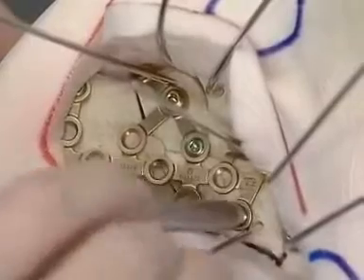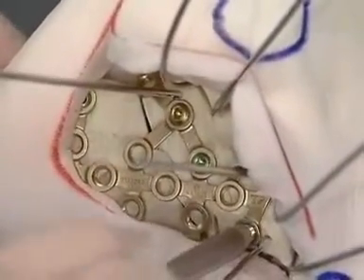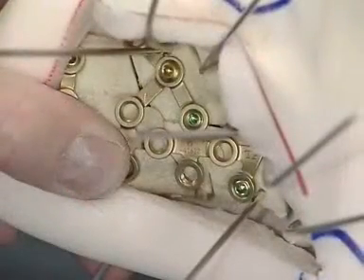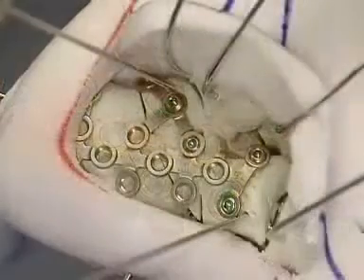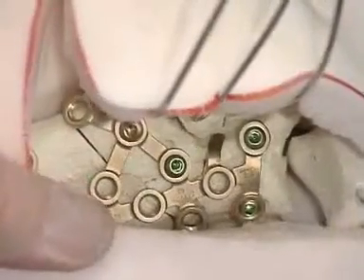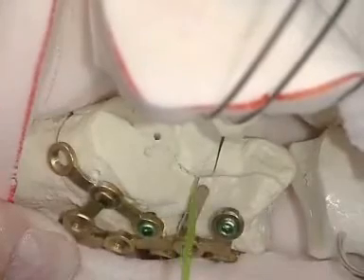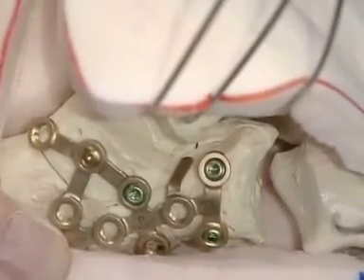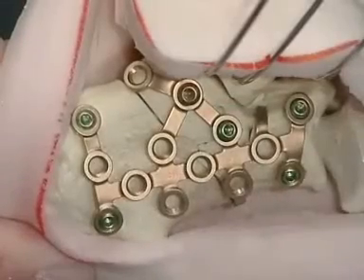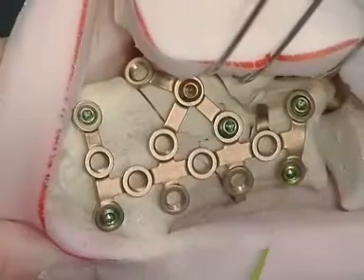After fine contouring of the plate, two screws are placed close to the calcaneal cuboidal joint. As an option, the first screw can also be a 3.5 mm compression screw. In small calcaneal bones, 2.7 mm screws can be used instead of 3.5 mm screws. In total, six screws are used: two subtalar, two dorsal, and two close to the calcaneal cuboidal joint, where the grip of the bone is usually the best.